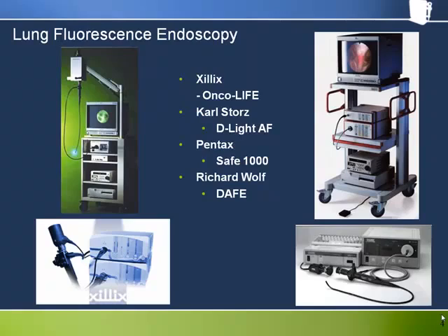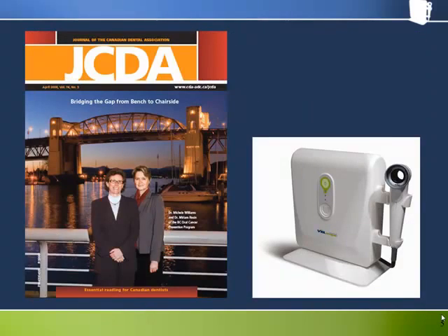The promise of this technique led other major manufacturers such as Storz, Pentax, and Wolf to develop their own lung fluorescence endoscopy systems. When the scientists and clinicians at the BC Cancer Agency turned their attention to using fluorescence in the oral cavity, early promising results led to a partnership with LED Dental to develop and then later commercialize what came to be known as the VELscope system.